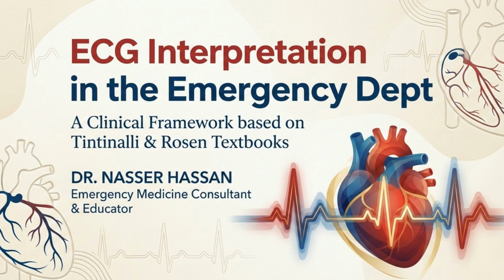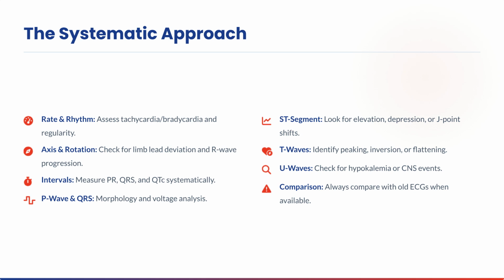This clinical framework is based on the authoritative Tintinalli and Rosen textbooks. A systematic approach to ECG reading is essential. Always assess rate and rhythm, axis and intervals, along with P-wave, QRS, and ST/T-wave morphology. Finally, compare with any old ECGs.